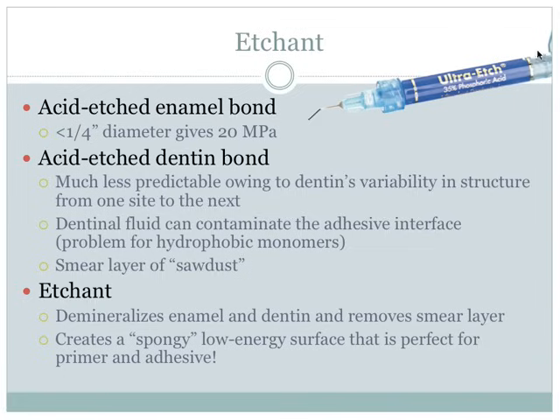All right, so etchant is another very common thing dentists use. It's a very strong acid, but it's used in a very controlled way. Obviously, the teeth are isolated. It's not going to be contacting soft tissue. And it provides for this bonding. It provides for adhesive dentistry, which is basically the whole concept behind how composites can work in filling a tooth structure.